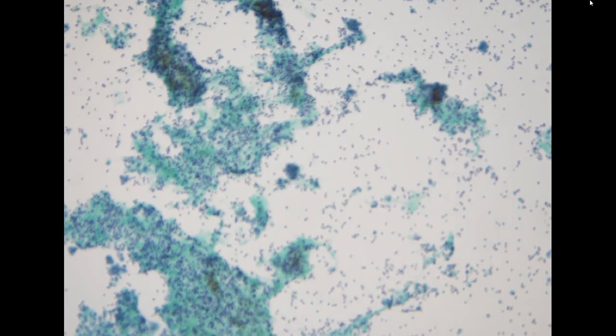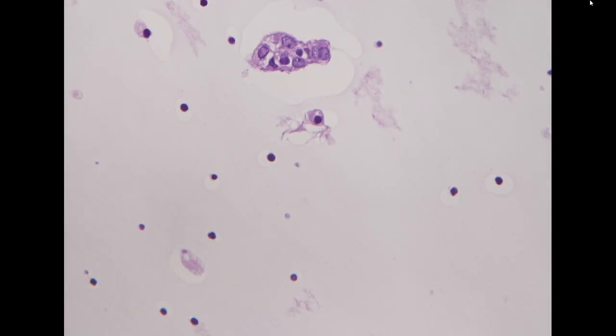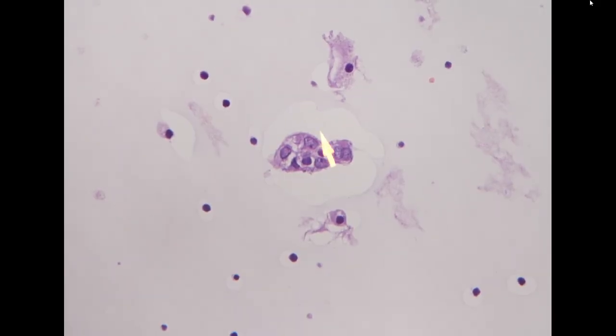So we would do PAX8 in addition to TTF1 to confirm, as this is the very first specimen in our hospital, so we need to confirm the origin of the tumor. In the cell block, there's only a very small cluster of cells. We will see if they are still there after recutting. We will check if it is positive for PAX8 or TTF1.